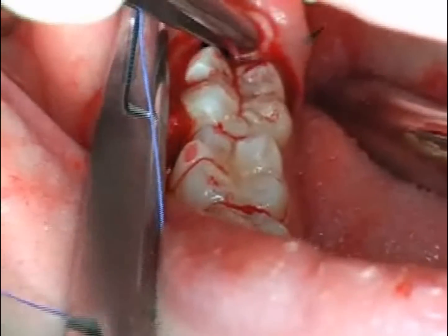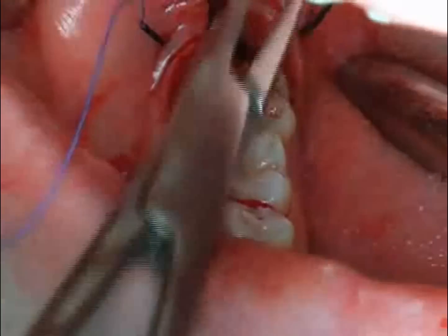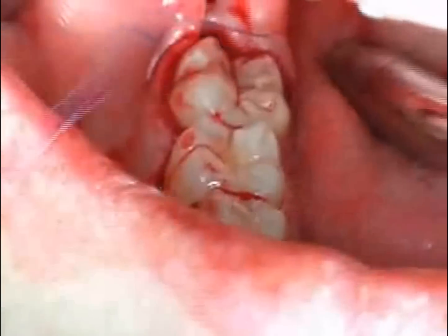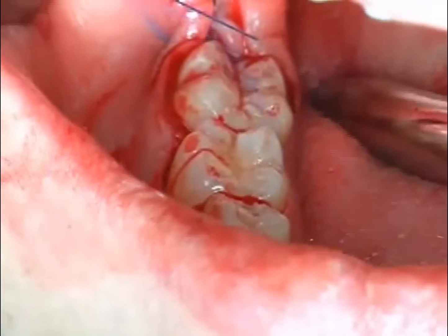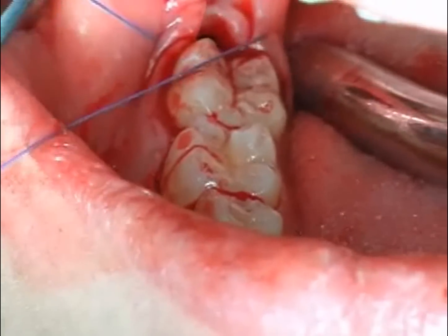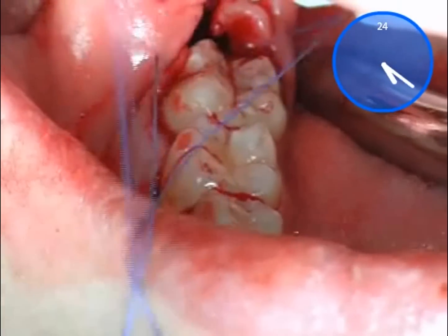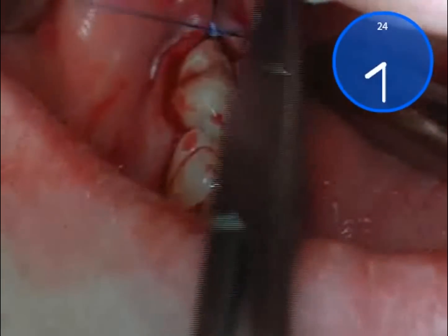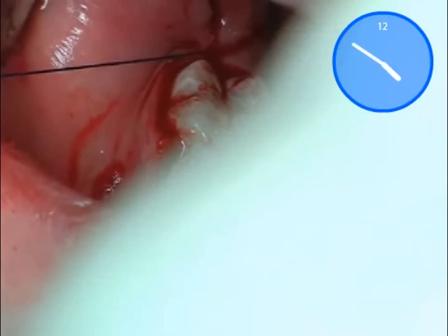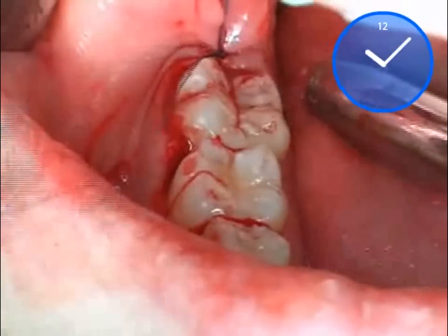Finally, a saliva-tight wound closure is performed. In most cases, an iodine strip is placed into the wound and removed the next day. As a rule, the swelling increases until the third or fourth day and then everything subsides. A week after surgery, the threads are usually removed.